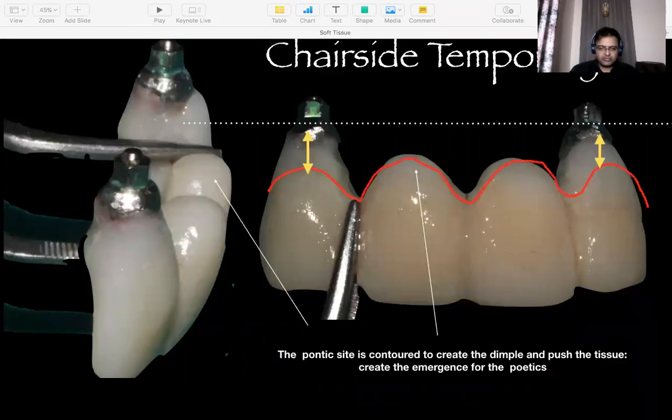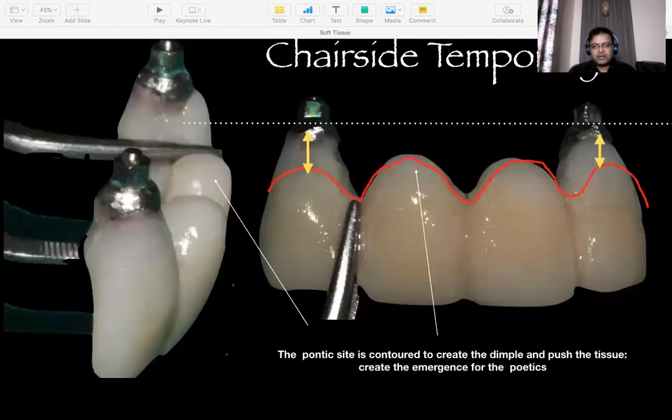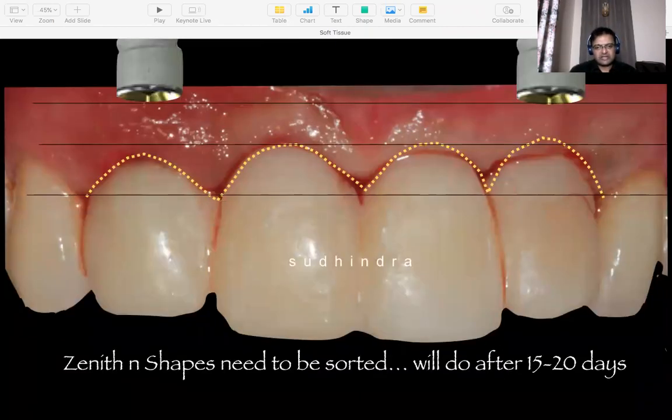So we made an impression of the implants, had the lab make a temporary, and this temporary went into the implant sites. And in the pontic areas, in the 2-1 and 1-1 area, the pontics also had the projection so that they would then start creating a pontic site for emergence. So that's how it got fitted.